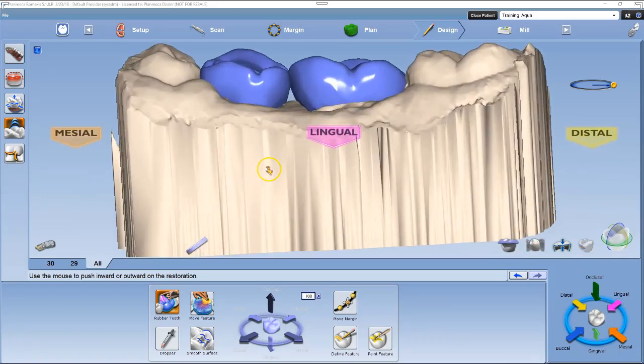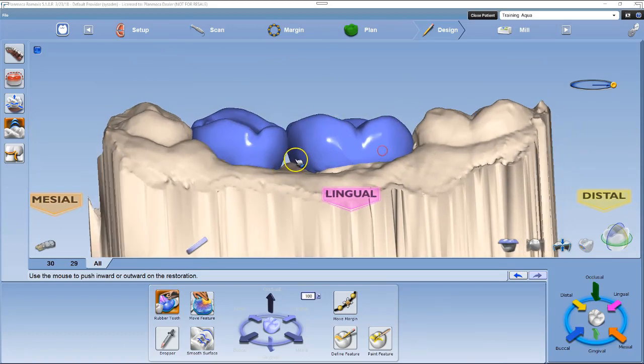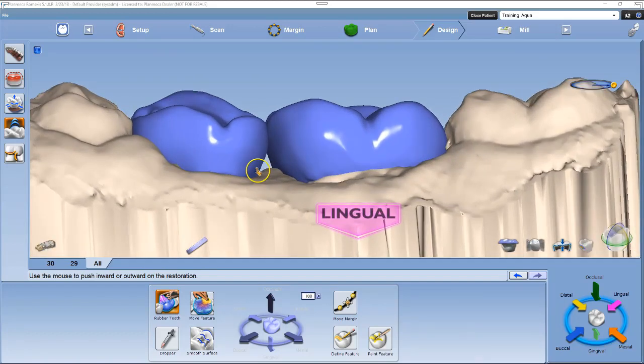The fifth step: left-click the lingual arrow in the quick view circle. Evaluate the cusp tips and adjust to the same height as the neighbors. Next, evaluate the concavities near the gum line and adjust as needed.